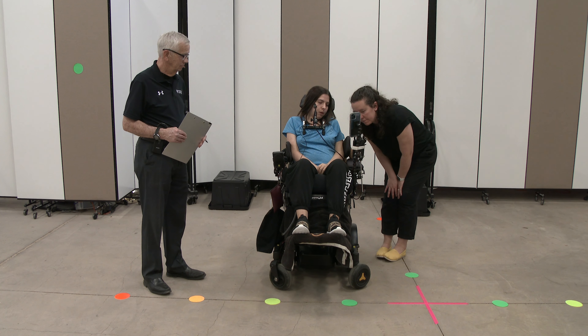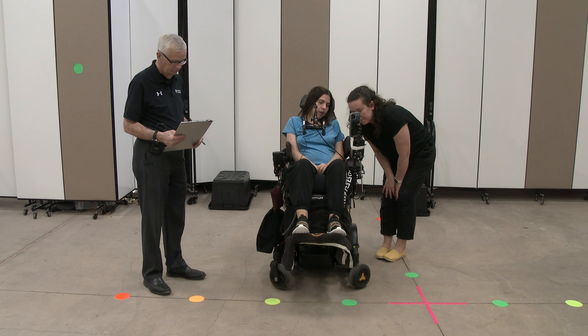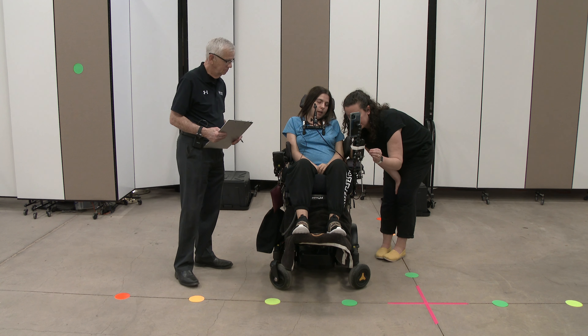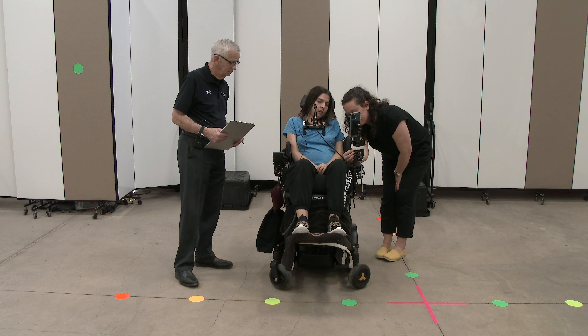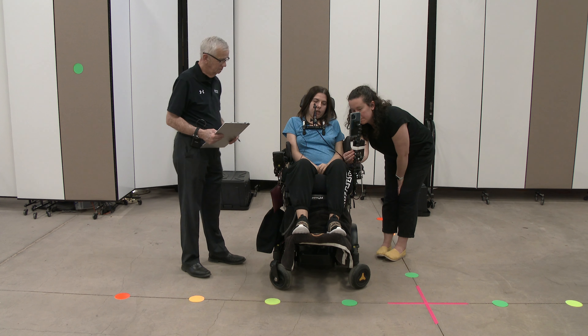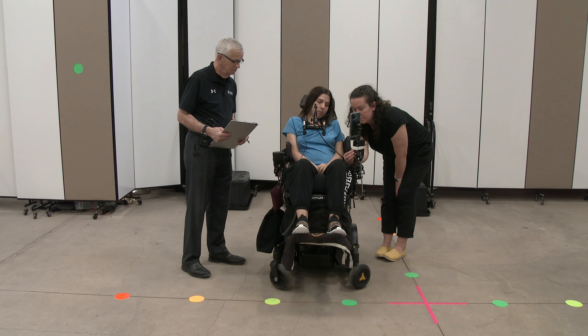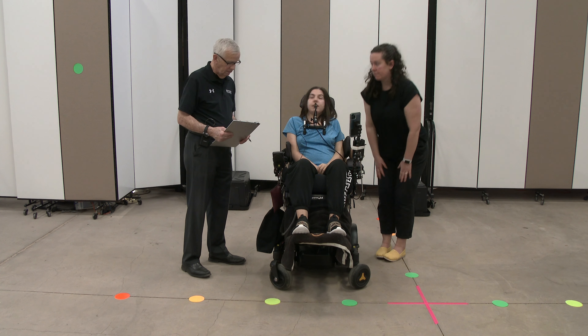So for the modes, if you click the blue button on the side where it says M, that gets me to seat positioning. And then if you click it again, that'll do Bluetooth. And then if you want to go back to profile so I can drive, you'll hit the P button. Hit the mode button one more time. There we go. That's how we do it.